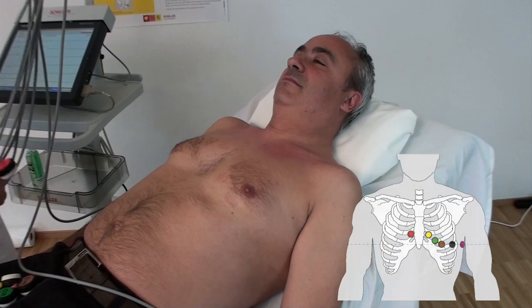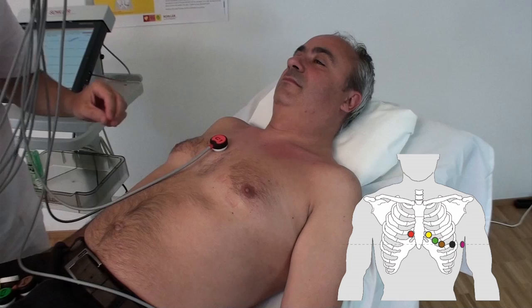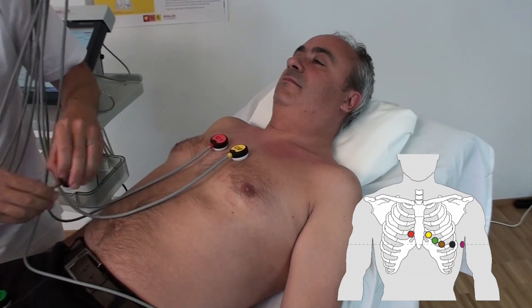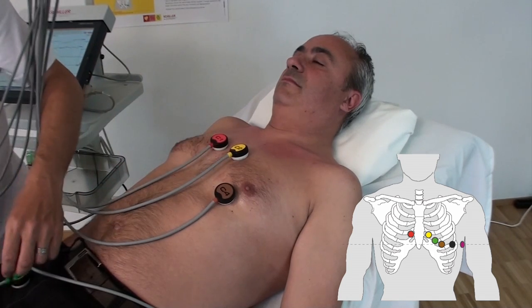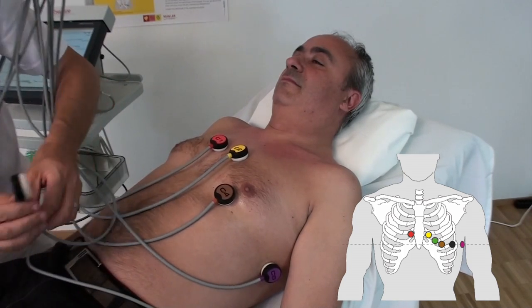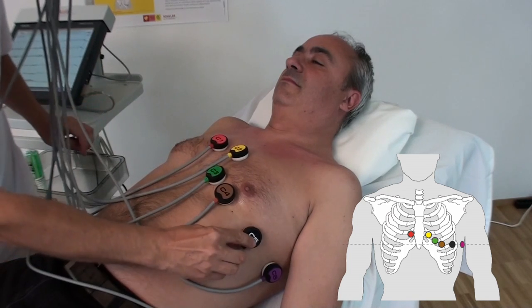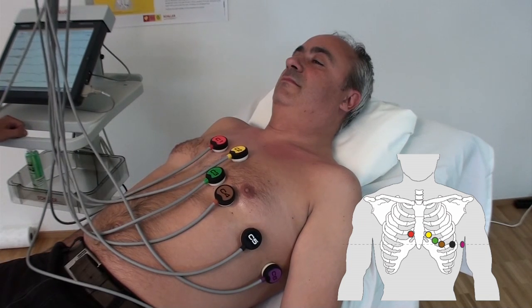C1: 4th intercostal space at the right sternal border. C2: 4th intercostal space at the left sternal border. C4: in the 5th intercostal space on the mid-clavicular line. C6: mid-axillary line at the same height as C4 and C5. C3: between C2 and C4. C5: on the anterior axillary line at the same height as C4.